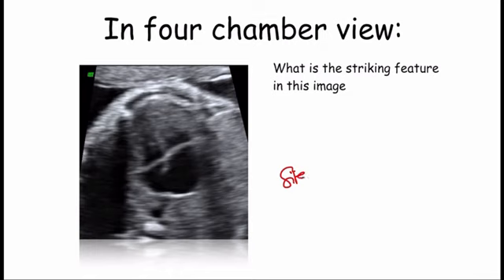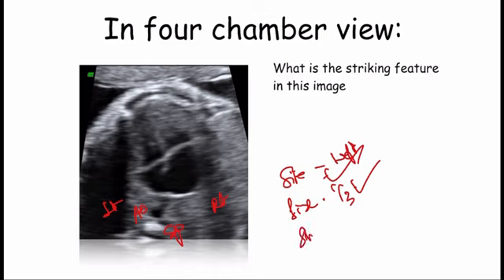First, you look for site. This left side, this right side, this the spine, aorta. Yes, the heart is in the left side. Site is normal. Size 1/3, 1/3, 1/3. So yes, size appears to be normal. Size of the heart as a whole. Shape.